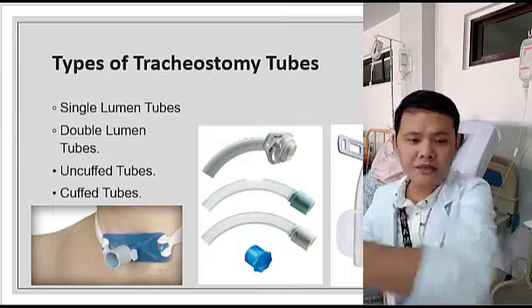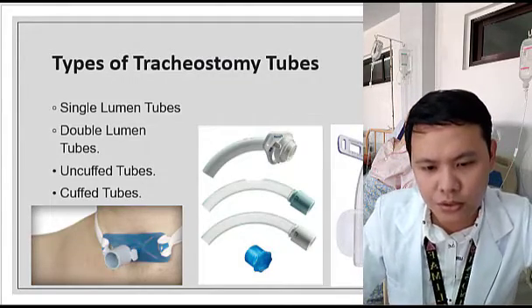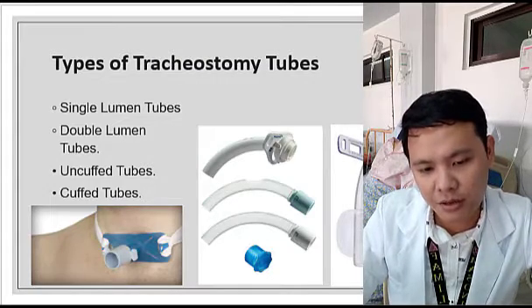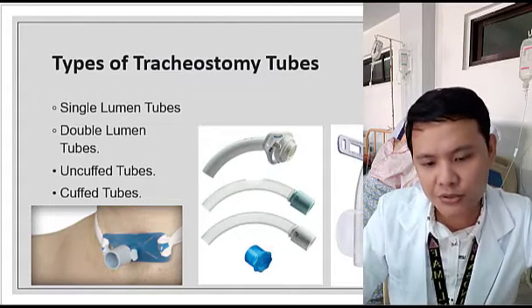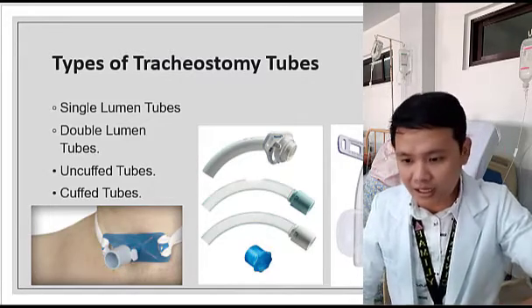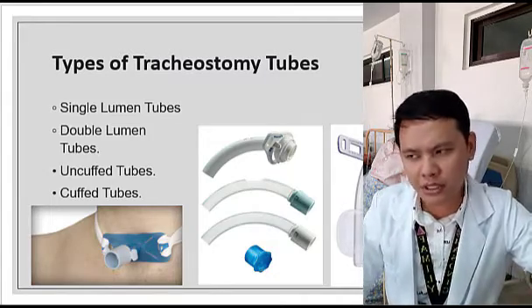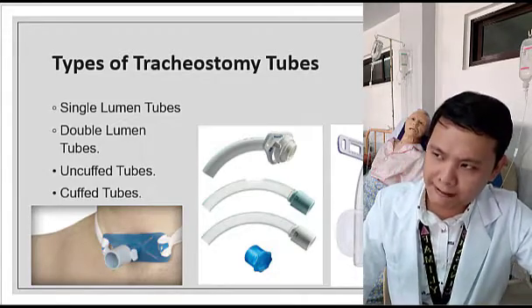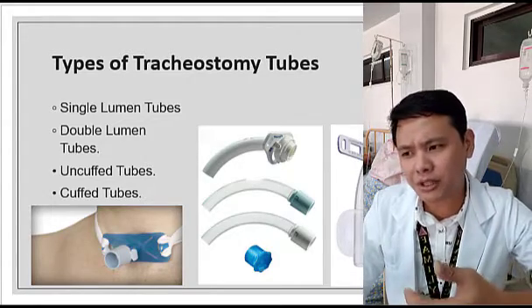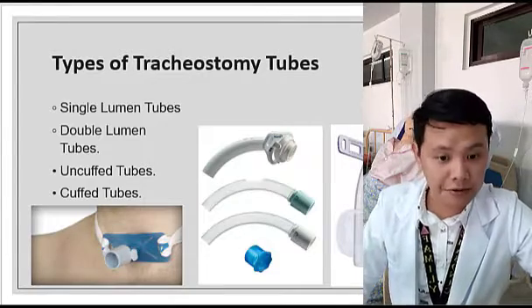And also, as you can see here in the picture, okay, the second picture, it shows the uncuff tubes, wala po yan cuff. Okay, on the third picture, should I say last, as you can see, ito pinakita ko sa inyo na balloon. Okay, that one will serve as a lock para dun sa may tracheo. Okay, nang sa ganun, hindi siya nagagalaw and it also prevents the trauma inside your trachea. Kasi delikado yun. Later, I will tell you what are the risks and complications na pwedeng ma-encounter ng isang tao.